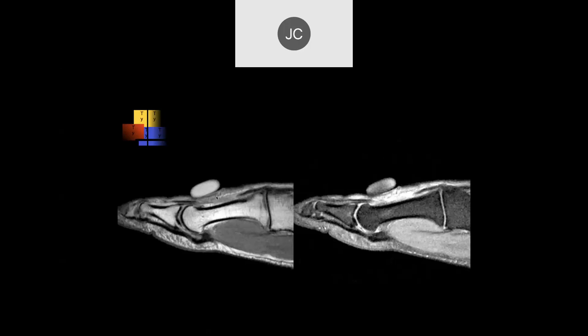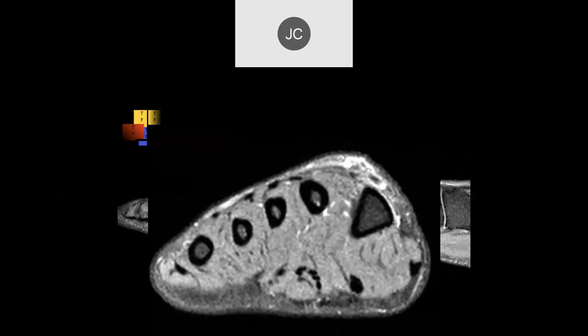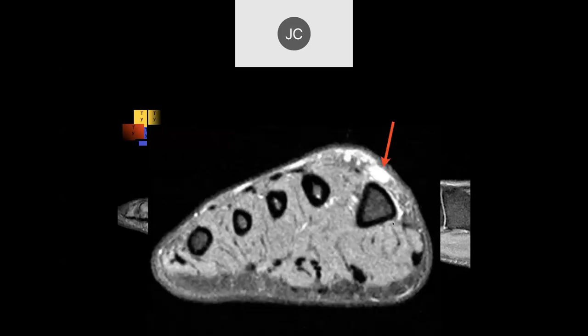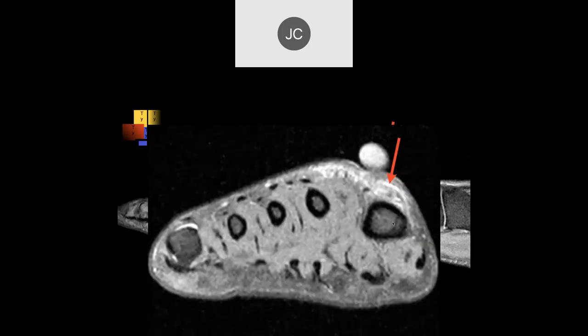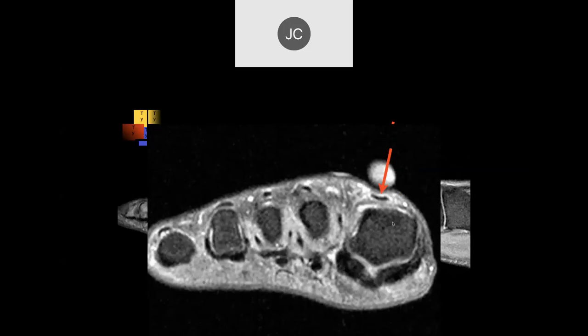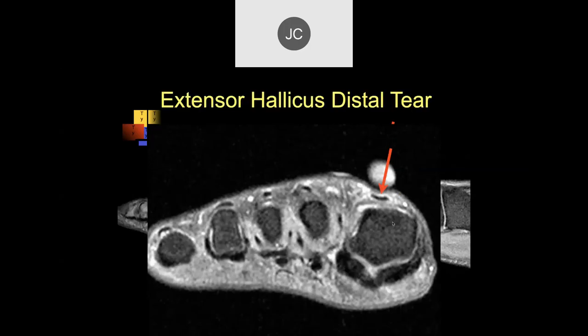There's edema, thickening, and increased signal in the extensor hallucis longus tendon. Going through sequential images, here's one image, the next image — there's the complete tear. Then the next image shows a complete tear with a little retraction of the tendon.